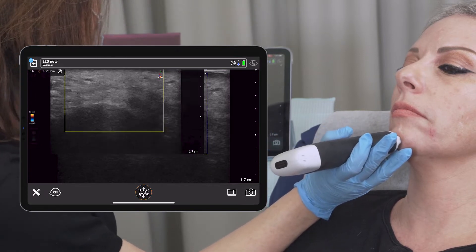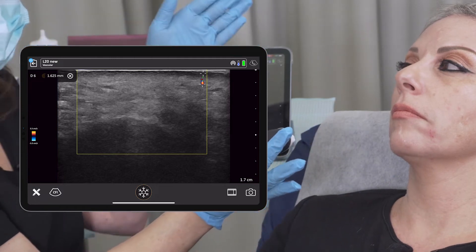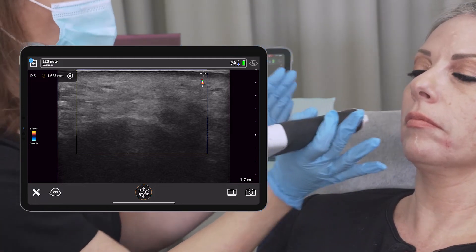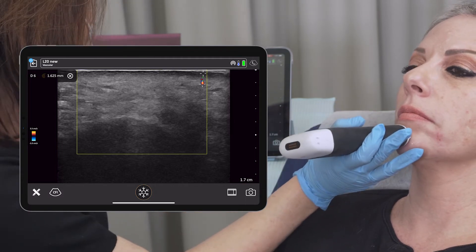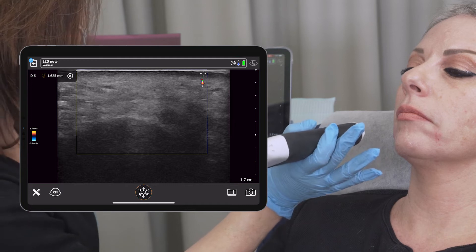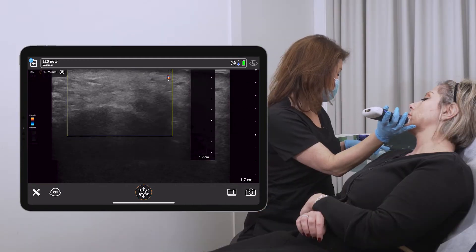If we go deep and inject deep onto the bone, we will be safe in this area on this side. Let me do the other side.